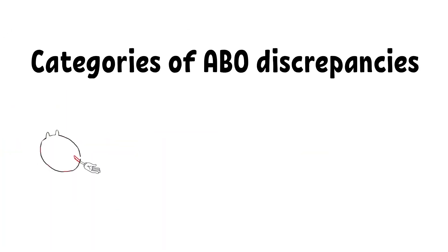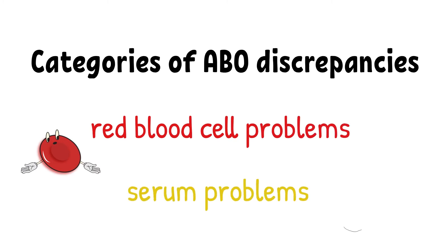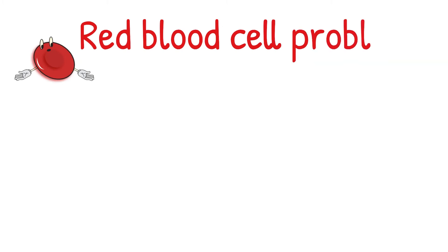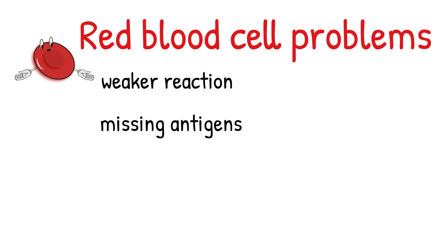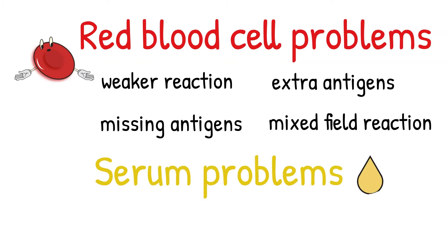There are different ways to category the discrepancy, but I like to group them into two groups: red blood cell problems and the serum or plasma problem. The red blood cell problem is when weaker reacting due to missing antigens or having an unexpected reacting due to extra antigens or having mixed field reactions. The serum problem is also when weaker reactions or missing reactions but due to missing antibodies or having an unexpected reactions due to extra antibodies.